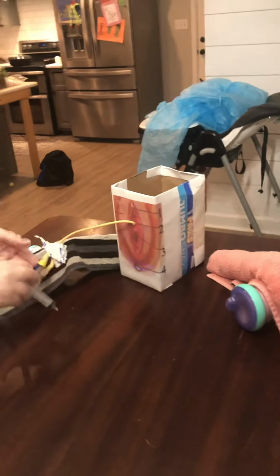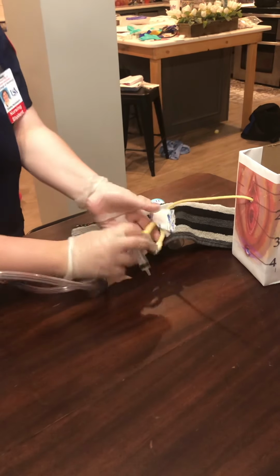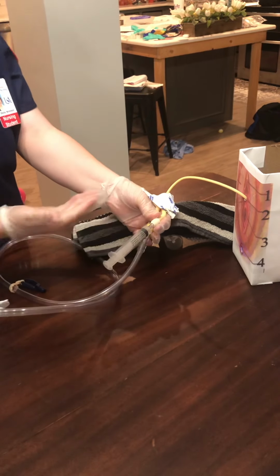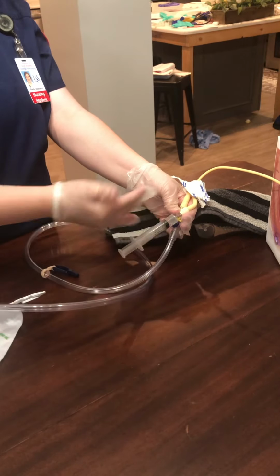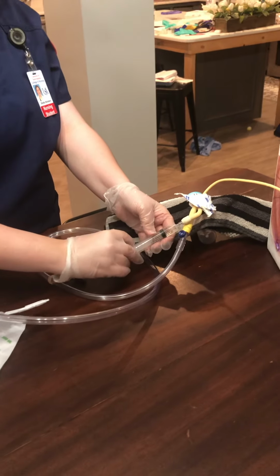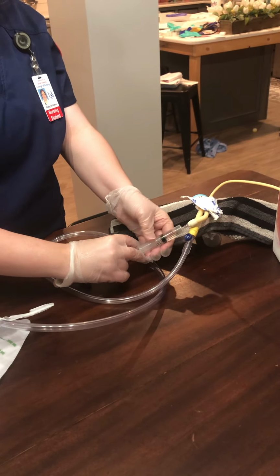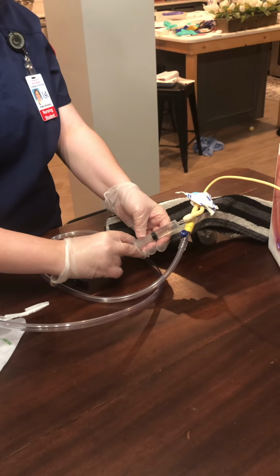So you're gonna get 0.5 milliliters of air in your syringe, and then put it in there, and just let gravity take its course and pull all of the water out of there. And for the video's sake, I'm just gonna kind of assist in speeding up that process.